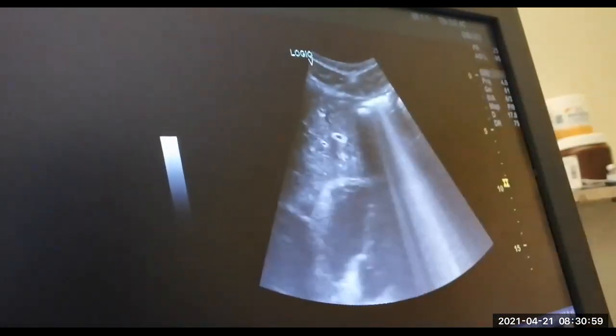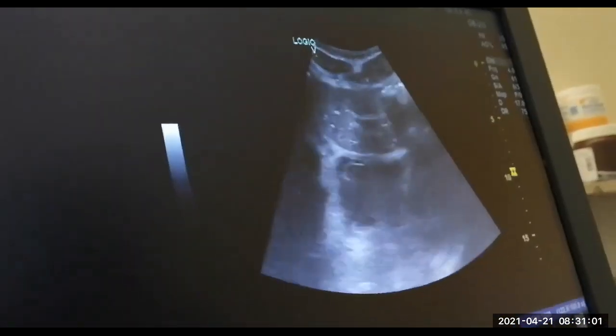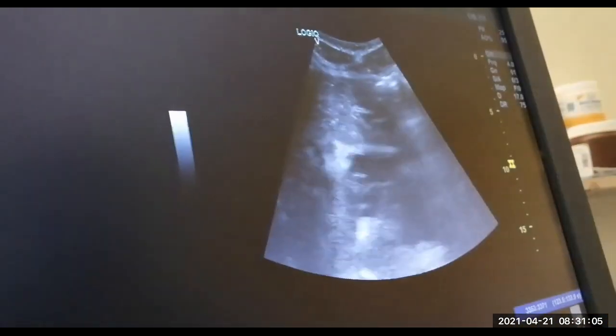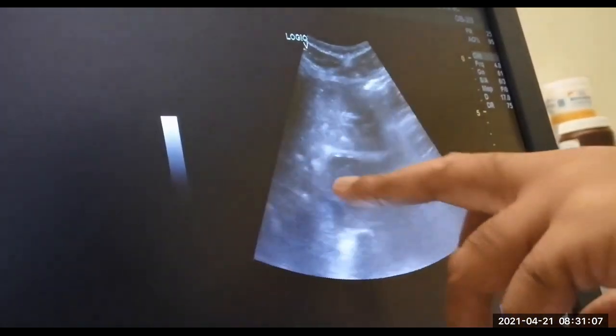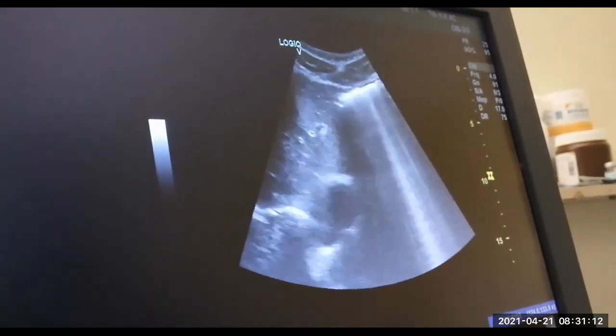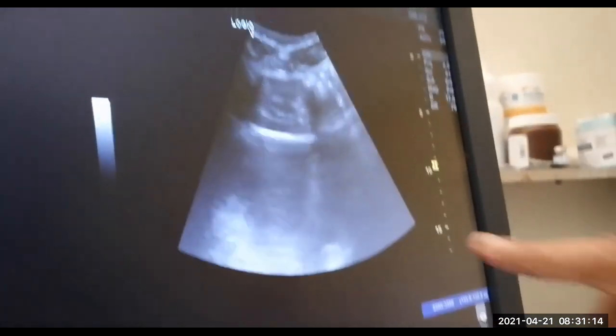The first thing that we see is the right ventricle. That's just a bit of gas from his tummy, and it will eventually go. All right. So here we can see the right ventricle, and we can see the right atrium. And there we can see the tricuspid valve that's actually pumping away over there. If we want to see the left ventricle, we have to try and look a bit more posteriorly, and there we see his left ventricle.